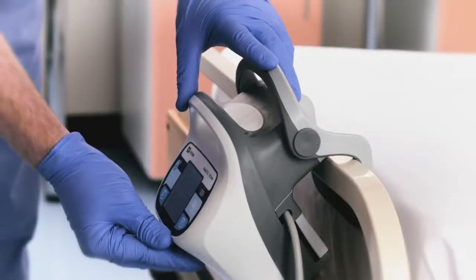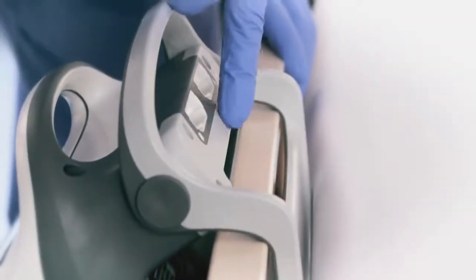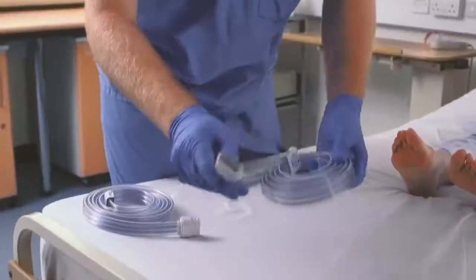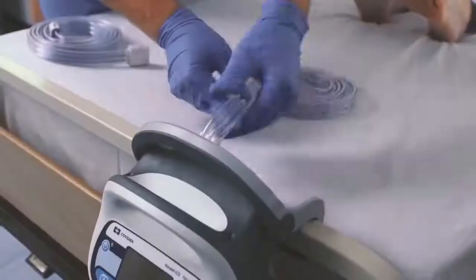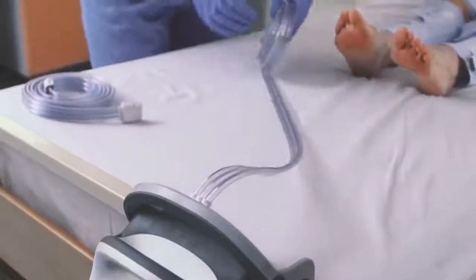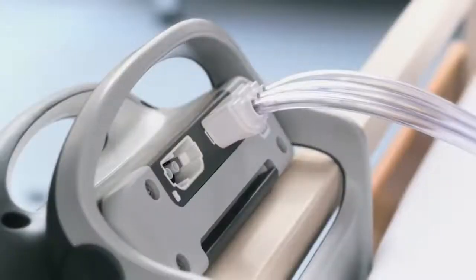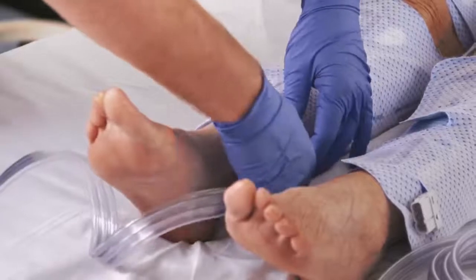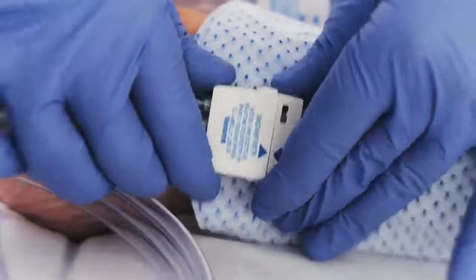Ensure that the device is securely fixed to the bed and that there is adequate airflow to the vents located at the power cord cover and below the tube set connection points. Plug the tubing sets into the back of the controller and then route the tubing toward the patient's limbs, being careful to leave access ways clear and eliminate tripping hazards. Plug the tubes into the sleeves, checking for kinks and ensuring a secure attachment.